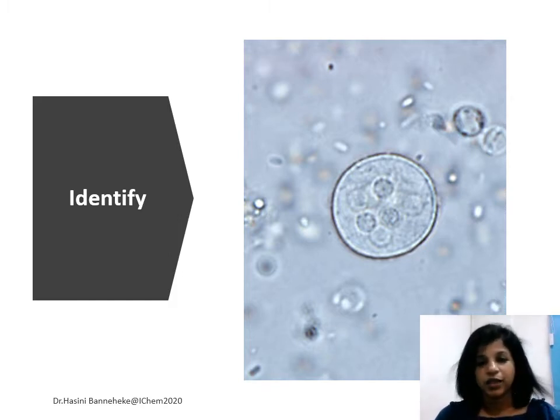Okay, so with that, when you apply that knowledge, try to identify what this is based on the shape of those cysts. As I have not given you the size, you can't decide on that, but look at the other structures. Take at least half a minute to decide on it, and then see whether you can recognize what it is.